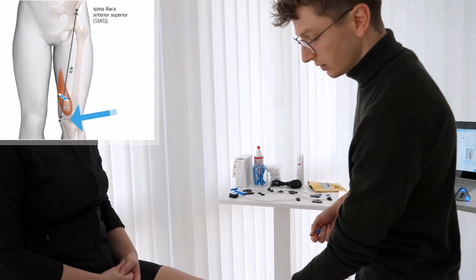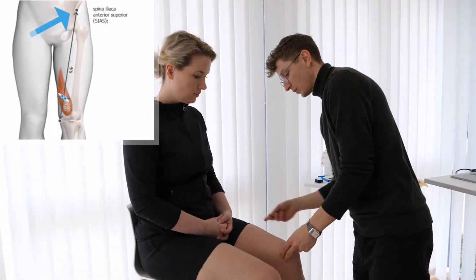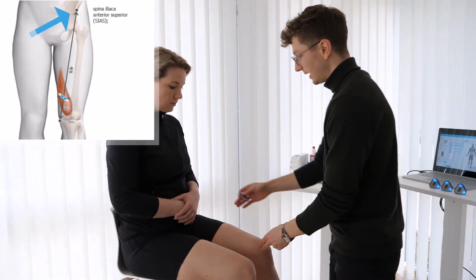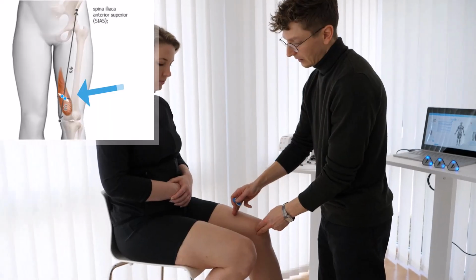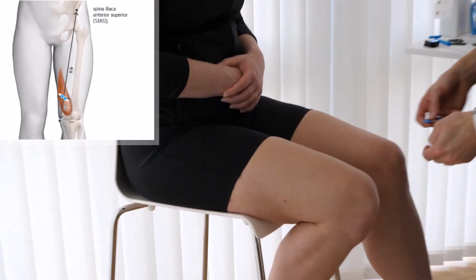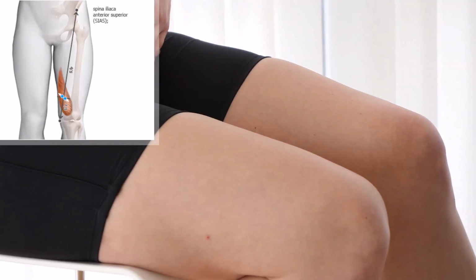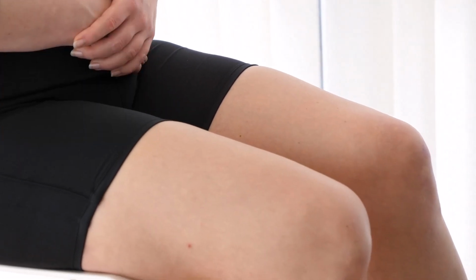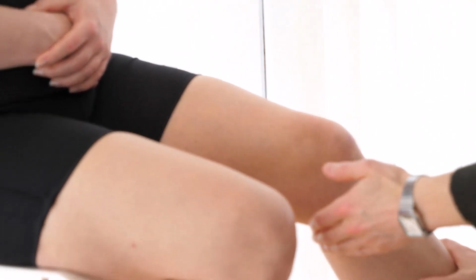For this, we look at the anatomical landmarks, which are the medial condyle of the knee and the ASIS. Approximately 80% from the ASIS is the optimal measurement position or electrode position. We also check this with a palpation and contraction and ask the patient to perform a contraction for this, which makes the vastus easy to palpate.